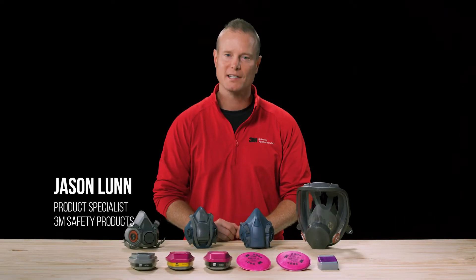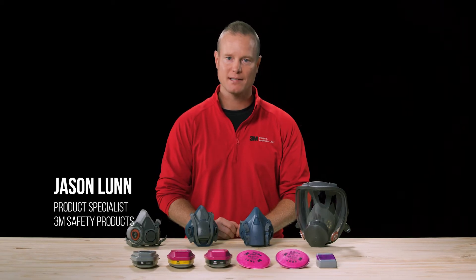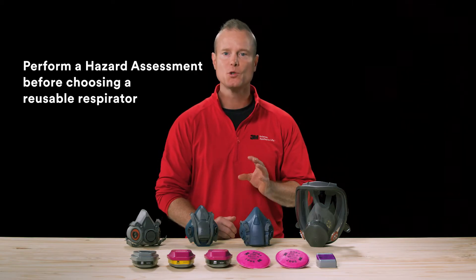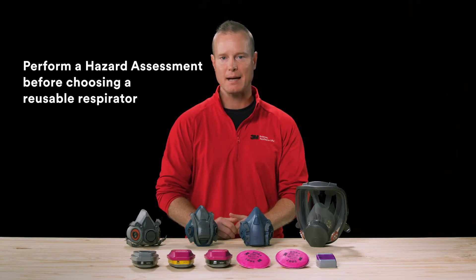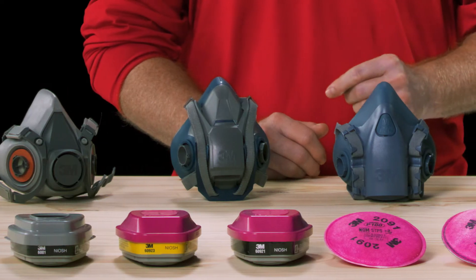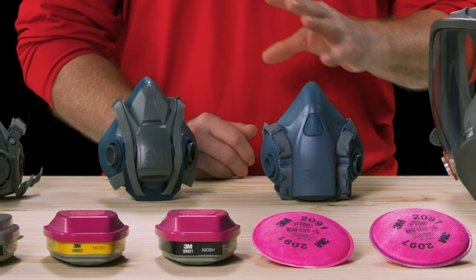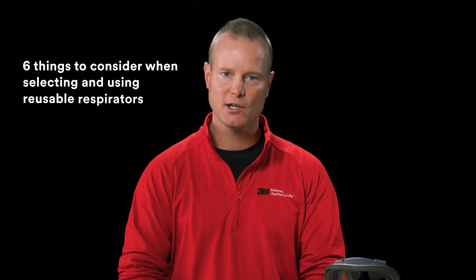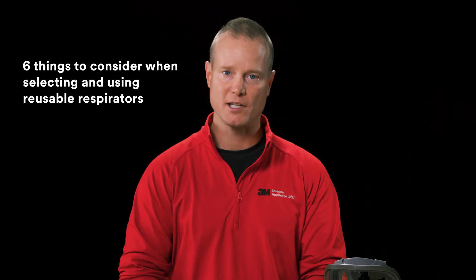Hi, I'm Jason Lund, product specialist for 3M Safety Products. Before choosing any type of reusable respirator, you must perform a hazard assessment to ensure you are selecting the right product for the application. This training is designed to help you understand other factors outside of the hazard assessment that are helpful to know. Here are six things to consider when selecting and using reusable respirators.